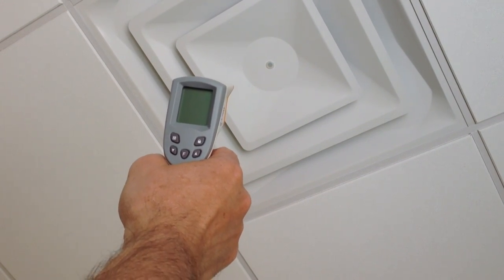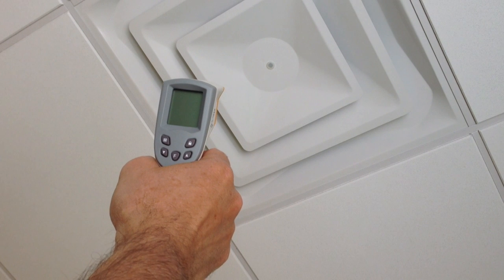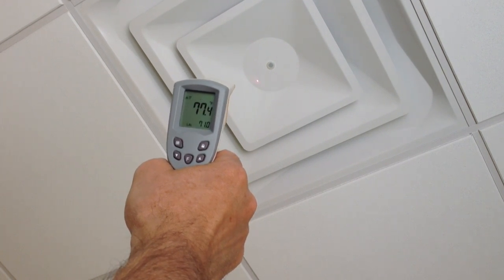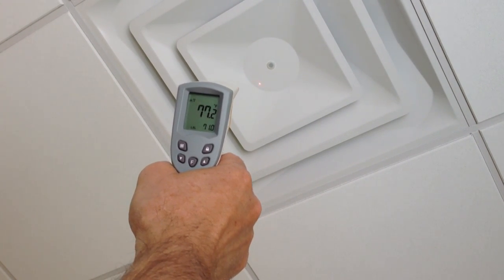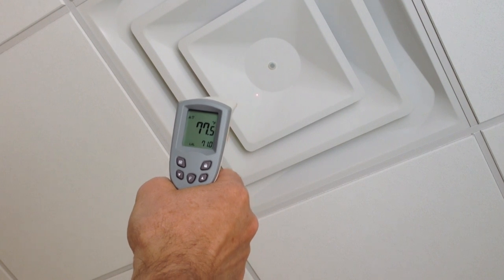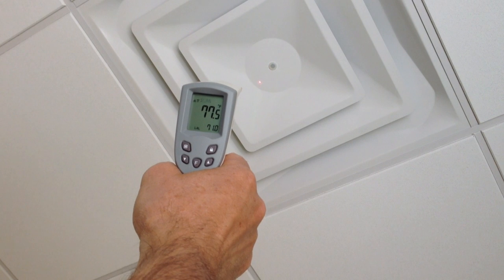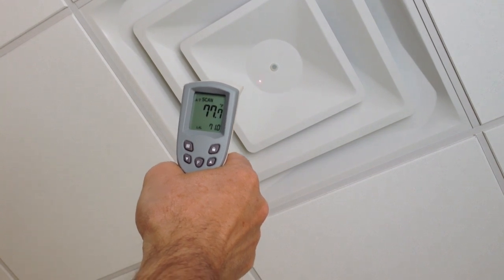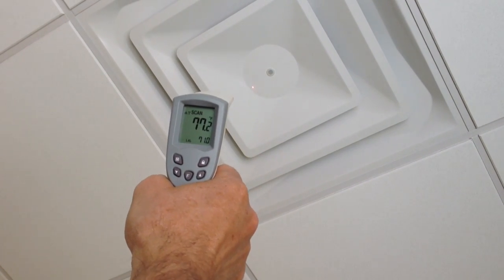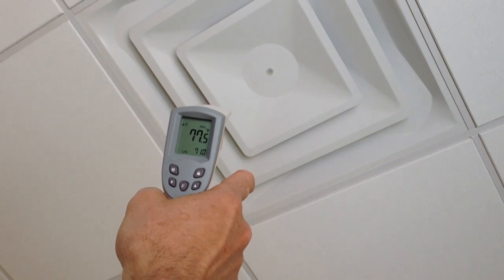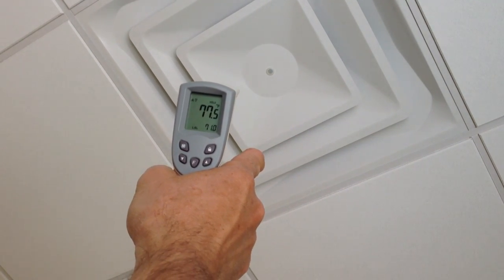To take a temperature measurement, simply hold the IR gun, press the trigger, and aim the laser guide at the target. Results immediately appear in C or F on the backlit LCD. Temperature readings are continually updated while the trigger is held. Once the trigger is released, the final temperature continues to be held for six seconds.